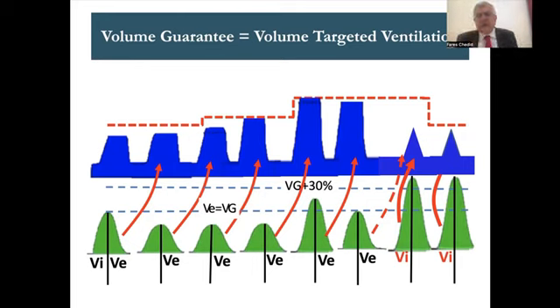It seems to be quite simple. The pressure produces volume, and the volume orders the pressure of the next breath. However, why do we use the volume expired, since the flow meter measures the volume that we take in as much as the volume that we expire out?